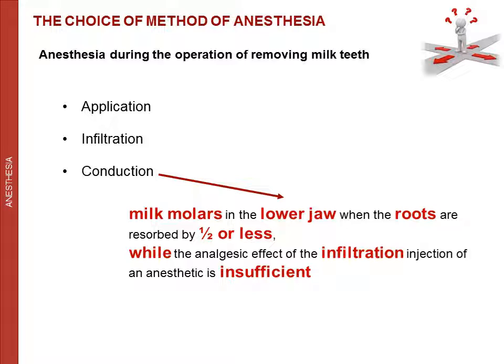In the removal of milk molars in the lower jaw, when the roots are resorbed by a half or less, the analgesic effect of the infiltration injection of the anesthetic is insufficient. In this case, conduction anesthesia is used.